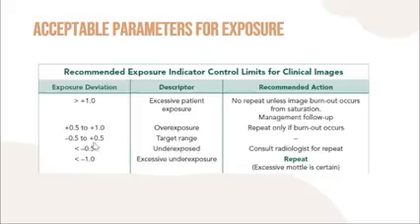Our target range is negative 0.5 to positive 0.5. In this case, for Fuji, we have 100 to 400, whose median value is 200, right? So the range is 100 to 400. Okay, this one is our target range. So we have no recommended action because your image is correct.